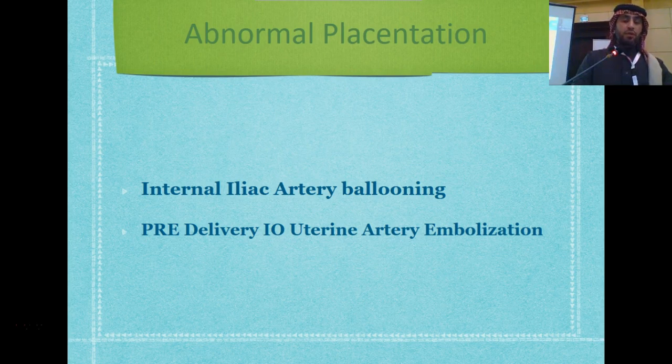The first one, which we have been doing for the last 13 years in our institute, is prophylactic internal iliac artery ballooning. Usually our colleagues, the obstetricians, call us, and it's very elective, so we can plan it. We do it early in the morning. It's the first case that we start with, 7 o'clock, patient on the table. We puncture both sides, both common femoral arteries, and then we insert balloons into the internal iliac artery.